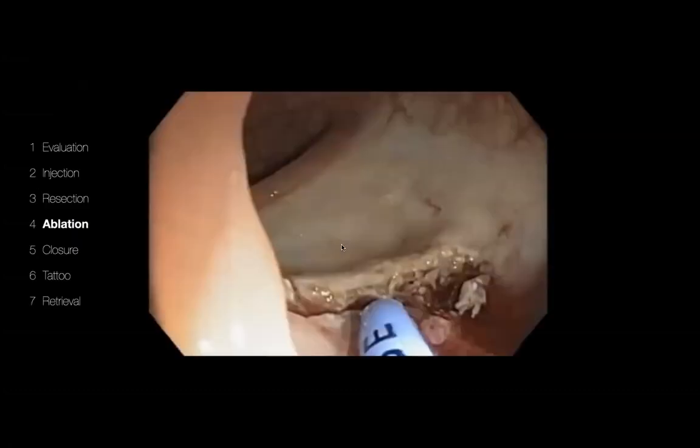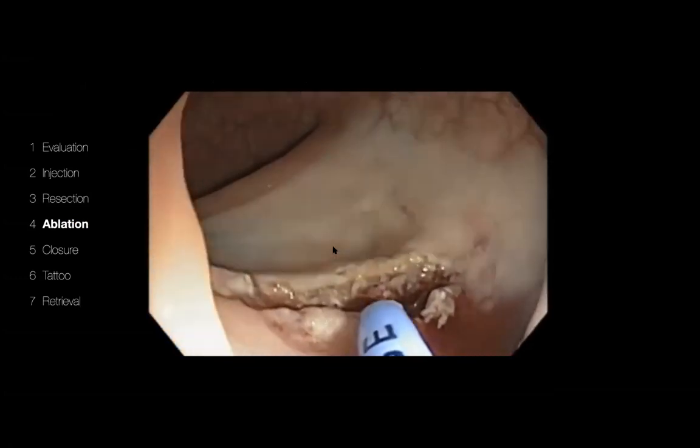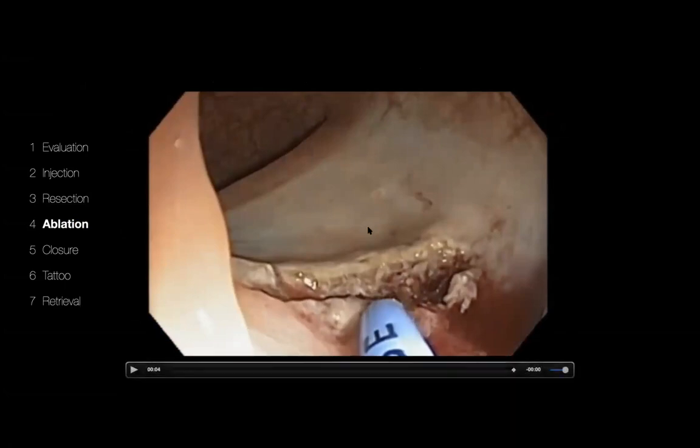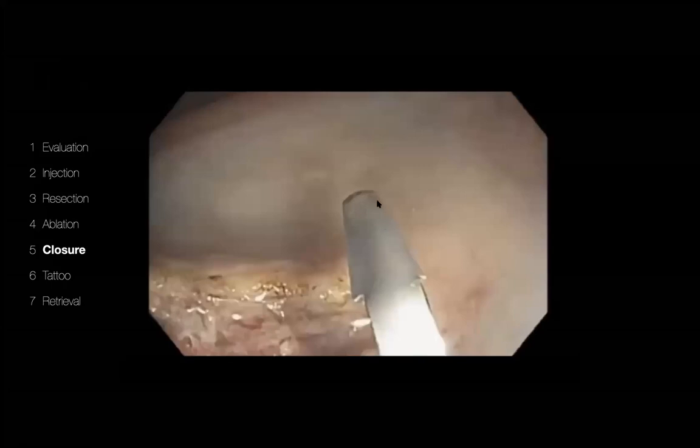All right. So this is what we did. We did APC, and for the sake of the video, I just have to show that we did the APC. I don't have the full video there. And then we closed the defect with clips.